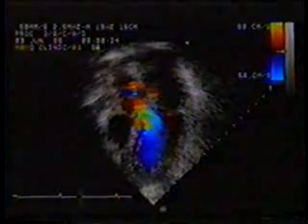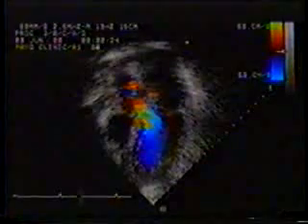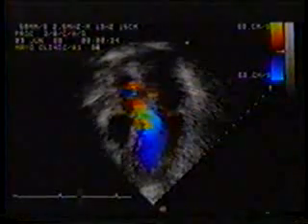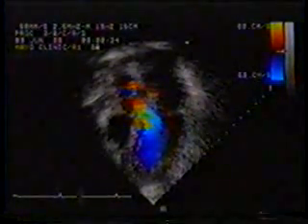Given the accuracy with which echocardiography can now characterize aortic stenosis, invasive catheterization for valve hemodynamics should only be necessary in a very small percentage of patients. This would include the less than 3% of patients in whom the echo study is technically inadequate for determining a valve area. Catheterization will also be necessary when there is discordance between clinical data and the echo findings.